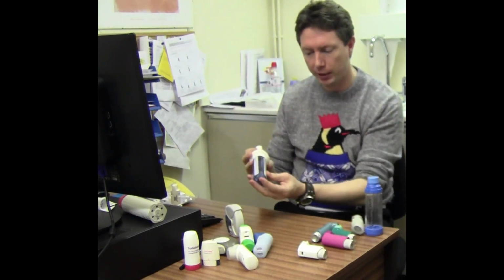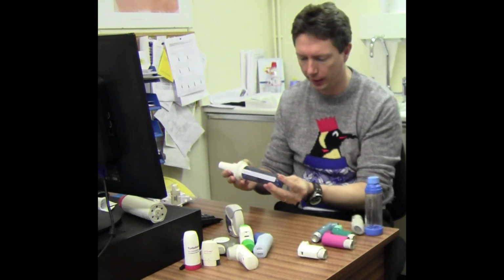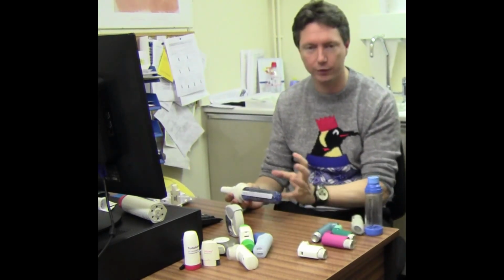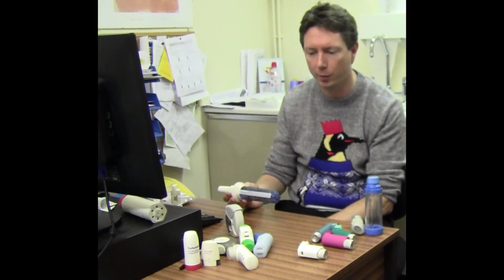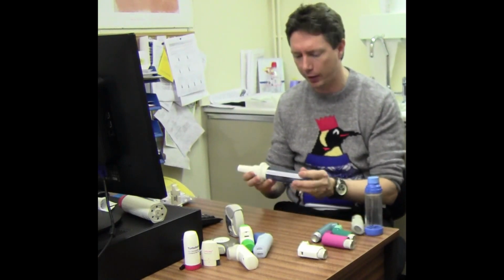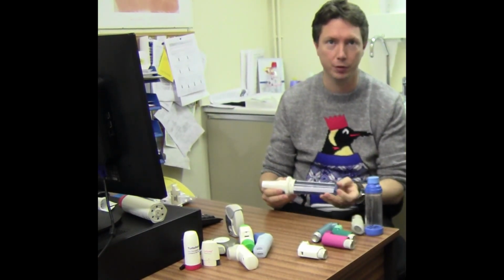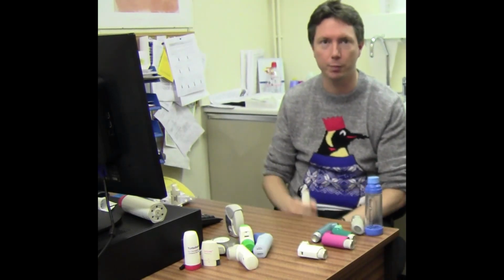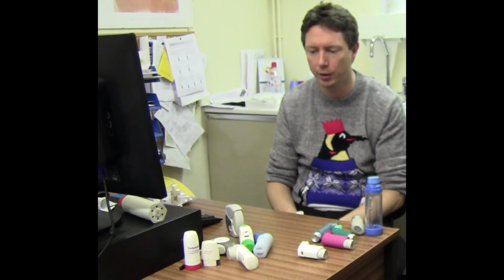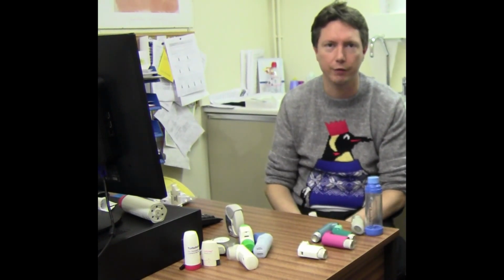And then it gives you a reading of the resistance they've generated to try and activate the powder in their inhaler. According to this, I've just managed 60 litres per minute, which only just fits in the recommended levels for the Turbohaler. So when you're evaluating the patient, it gives you an objective way and shows them how hard they should be breathing. It's also very instructive for people who are prescribing inhalers, to know what their patients should be able to do. There are new versions on the market, and there are different settings for different inhalers.